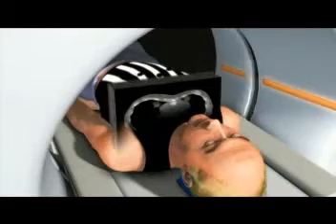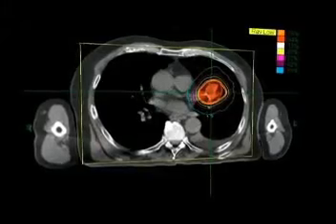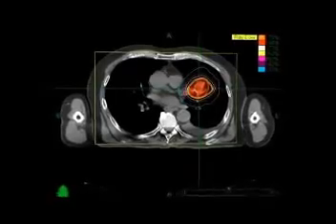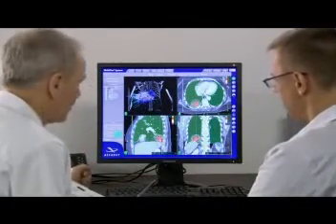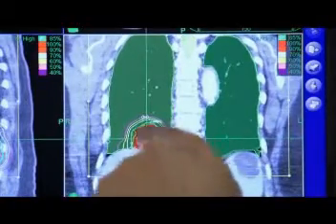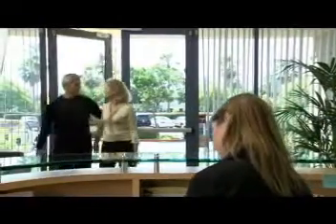Prior to the procedure, the patient is imaged using a high-resolution CT scan to determine the size, shape, and location of the tumor. Following scanning, the image data is digitally transferred to the CyberKnife system's workstation, where treatment planning begins. A qualified clinician then uses the CyberKnife software to generate a treatment plan. The plan is used to match the desired radiation dose to the identified tumor location, while limiting radiation exposure to the surrounding healthy tissue. Once the treatment plan has been developed, the patient is ready to undergo the CyberKnife procedure.